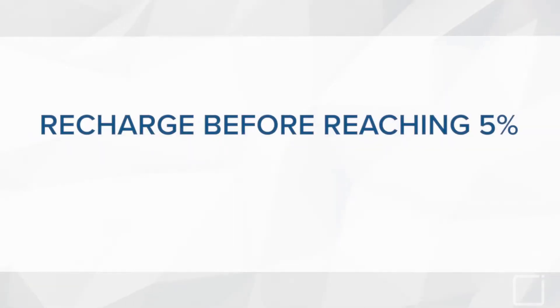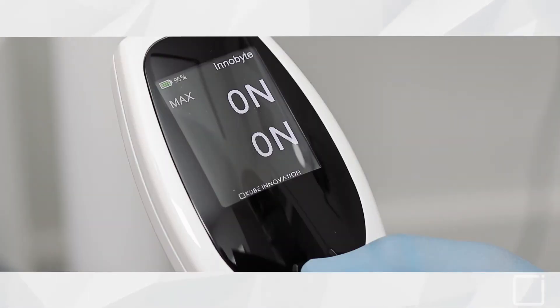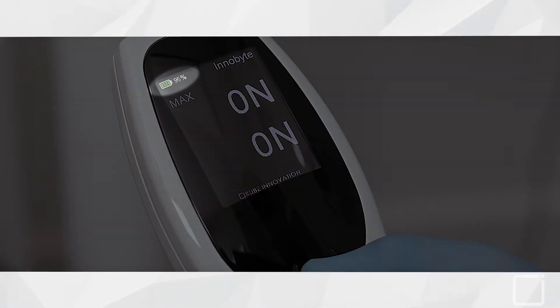We recommend that you charge your InnoByte prior to it reaching five percent residual battery. This can be seen on the upper left-hand corner of the device. It will take up to three hours to completely recharge your InnoByte.